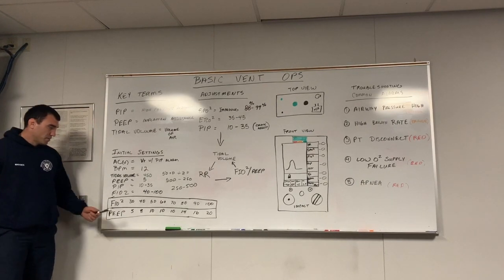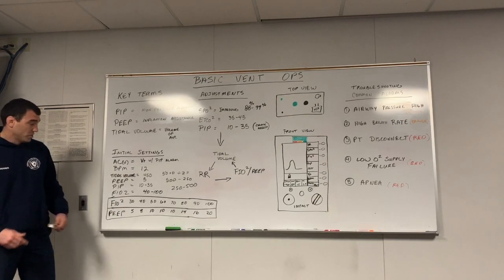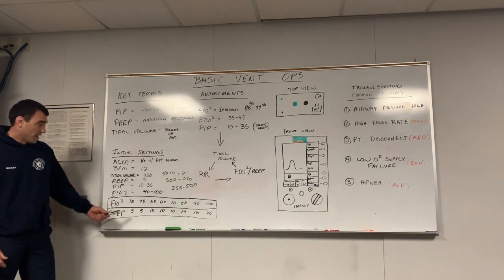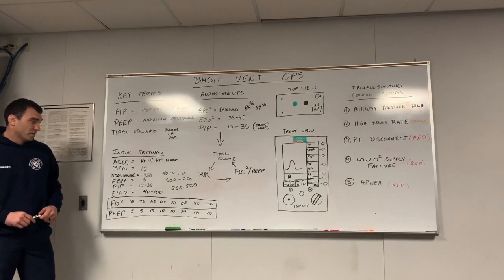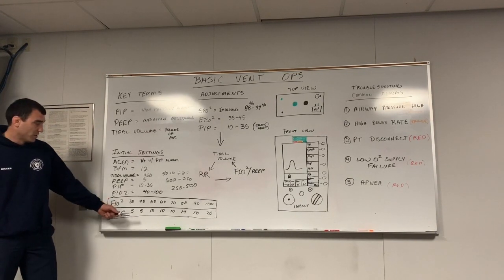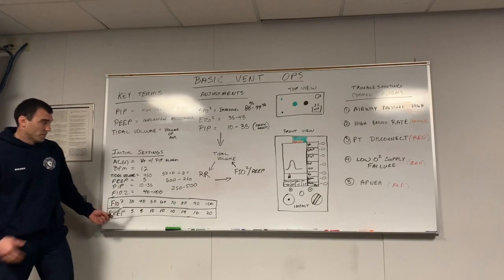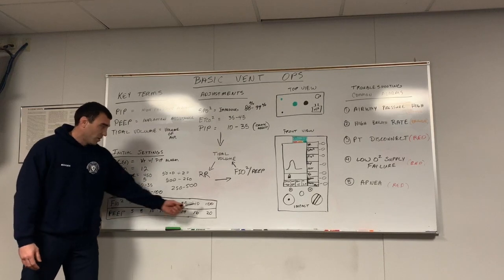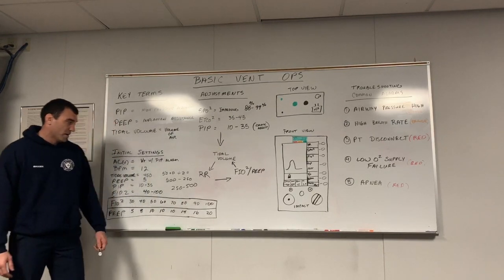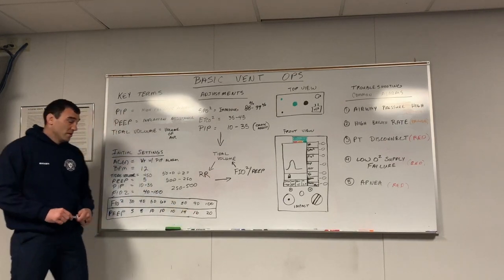Easy way I remember it is that anytime I go over 21%, which is room air, right? Anytime I make my adjustment, my PEEP's at 5. That's your standard. If you're using room air, you're using a PEEP of 5. As I make the adjustment, anytime the level of concentration of oxygen doubles, the PEEP needs to double. So if I went from 30 to 60, my PEEP doubles to 10. If I went from 25, we'll say roughly, if I go all the way up to 100, I increase my oxygen concentration by 4, so I increase the PEEP by 4 to equal that out.